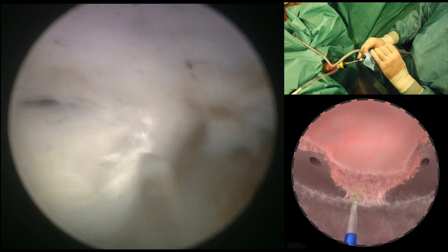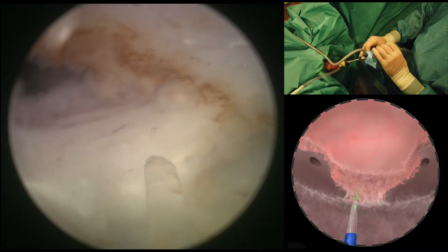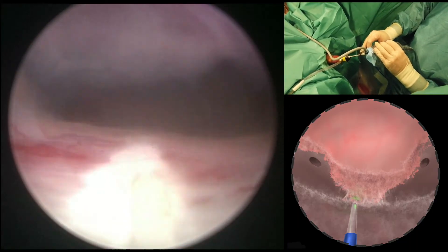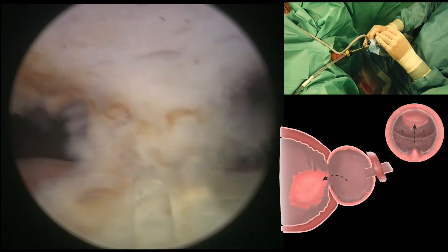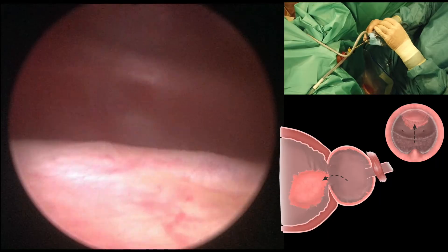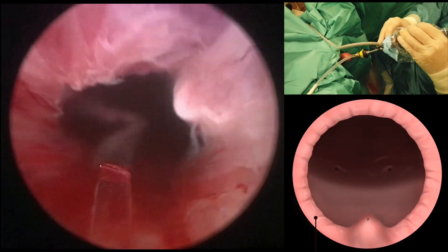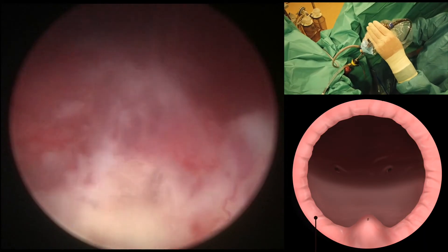This took about 40 minutes in this case. We are typically able to complete these operations in around one hour even for very large glands, where we might need maybe 10 or 15 minutes more than for smaller prostates. It's important to coagulate the mucosal vessels because these can bleed and they're a little bit difficult to see sometimes. You have to pay attention to the mucosal bleeders. Here you can see the excellent preservation of the sphincter, and a little bit of hemostasis has to be carried out, especially in very large glands.